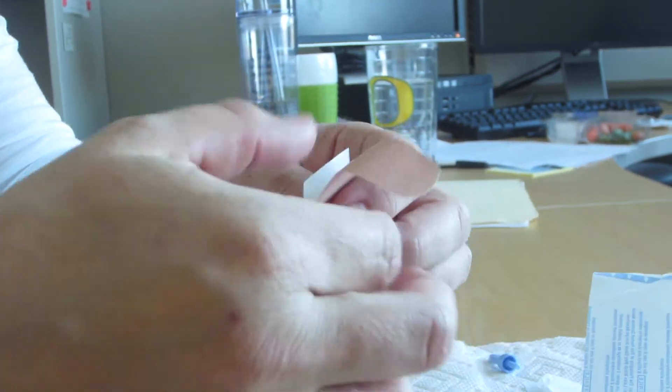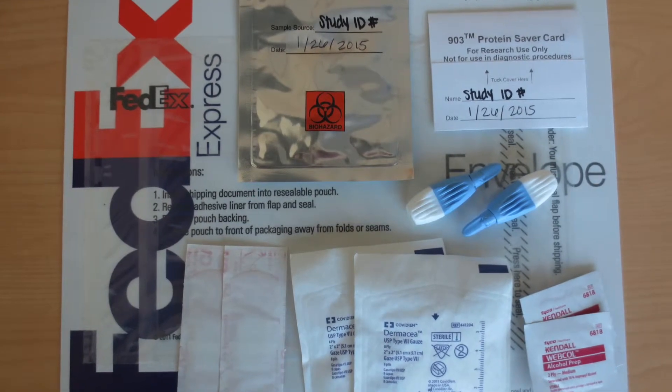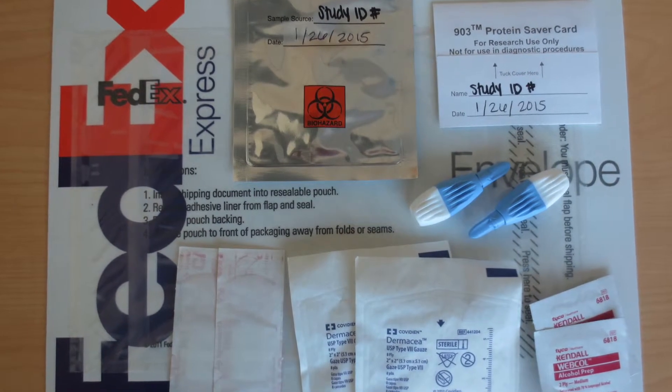Allow the dried blood spot card to air dry for at least two hours at room temperature. Then follow the written instructions for mailing back the sample by FedEx. Thank you.